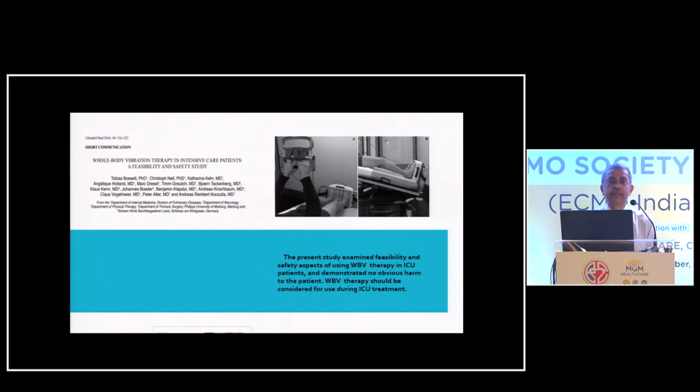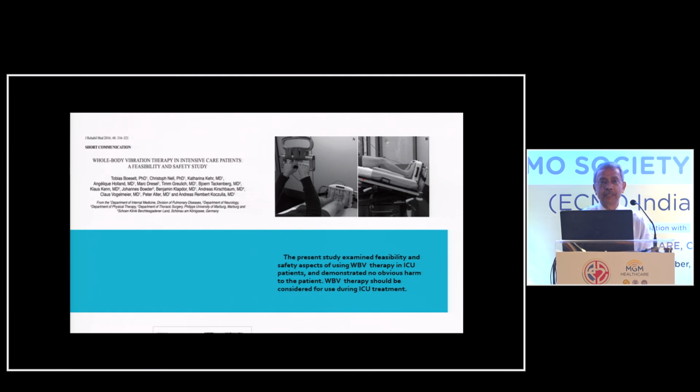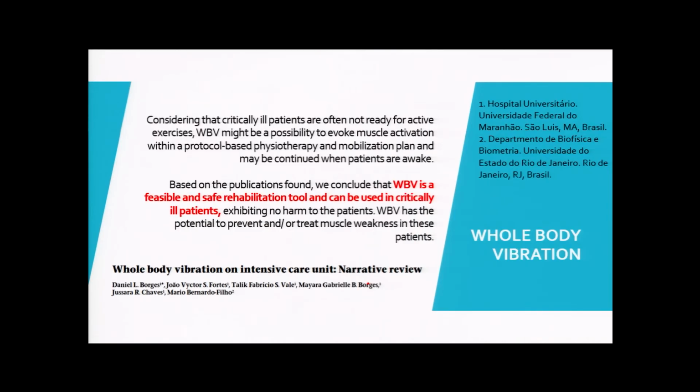This is going to be a game changer very soon, not available in India now, but it is the future. Whole body vibration therapy. This study comes from the University Hospitals of Germany. The present study examined feasibility and safety aspects of using whole body vibration therapy in ICU patients and demonstrated no obvious harm to the patients. Whole body vibration therapy should be considered for use during ICU treatment. It's another green signal from the University Hospital, Brazil. Whole body vibration is a feasible and safe rehabilitation tool and can be used on critically ill patients.